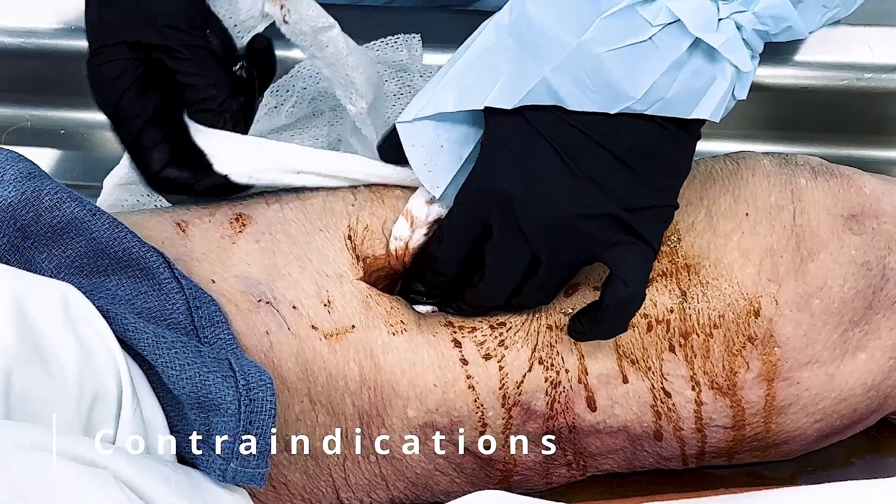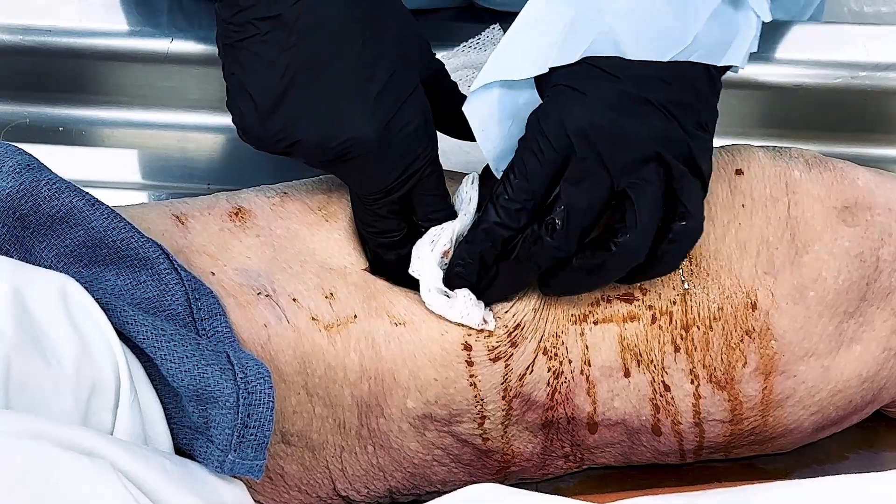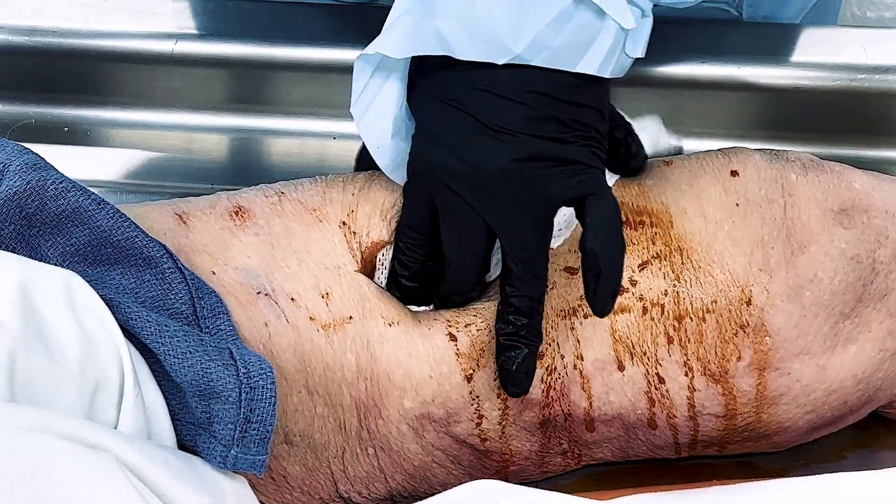Please note that quick clot cannot be used on thoracic or abdominal trauma, internal wounds, sucking chest wounds, exposed bowel, and eye injuries.